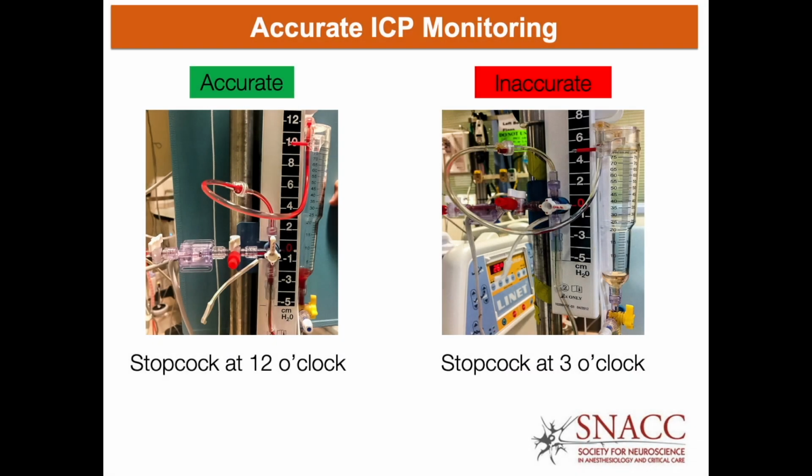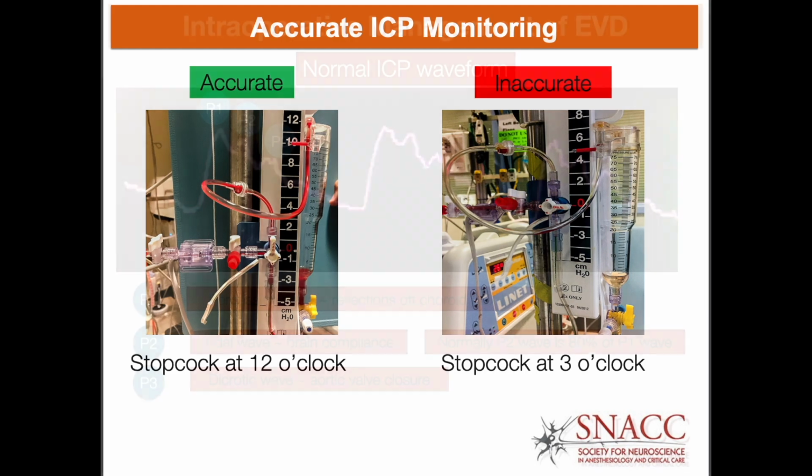Let's now turn our attention to the intraoperative management of patients with external ventricular drains. It has been noted several times in this video that the stopcock position that's in line with the EVD and the collecting system plays an essential role in the care of patients with EVDs. The stopcock in the 12 o'clock position denotes accurate measurements of intracranial pressure, whereas the stopcock in the 3 o'clock position, or open to drain position, will not give you accurate intracranial pressures, but will allow for the removal of cerebrospinal fluid from the patient.